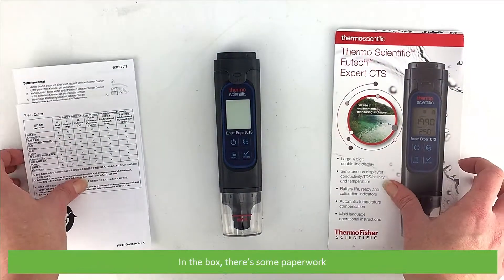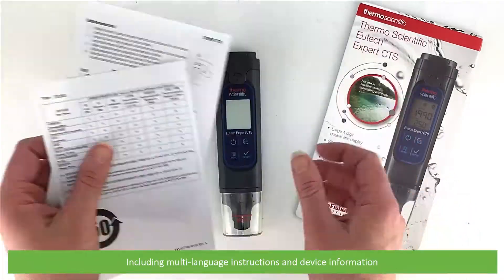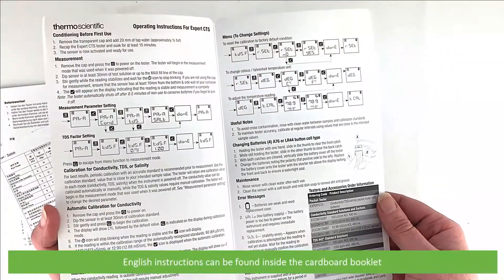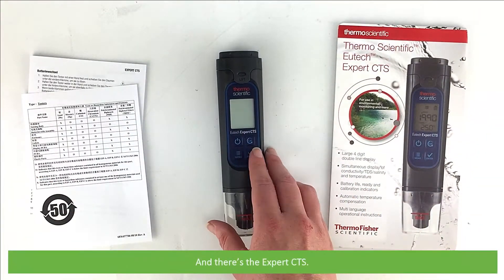In the box there's some paperwork including multi-language instructions and device information. The English instructions can be found inside the cardboard booklet, and there's the Expert CTS.